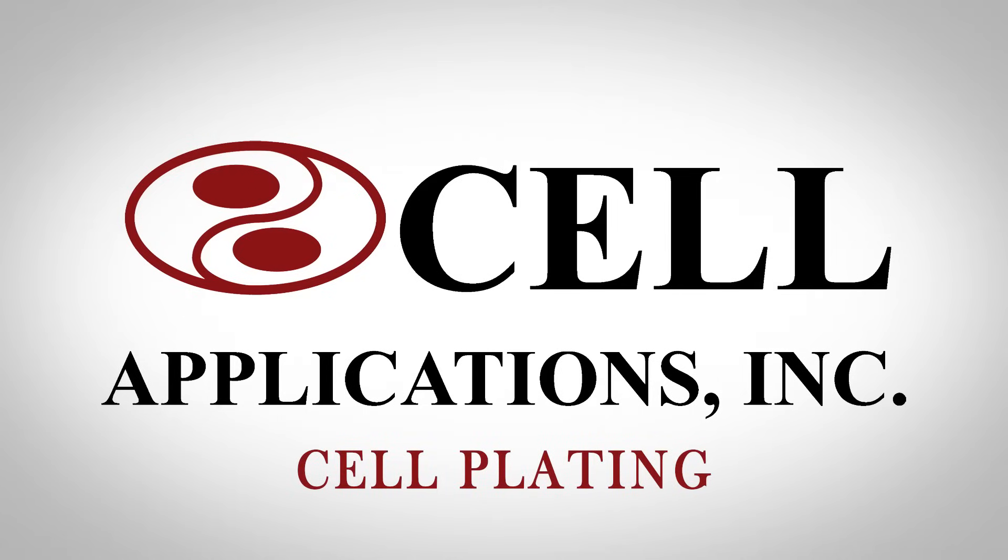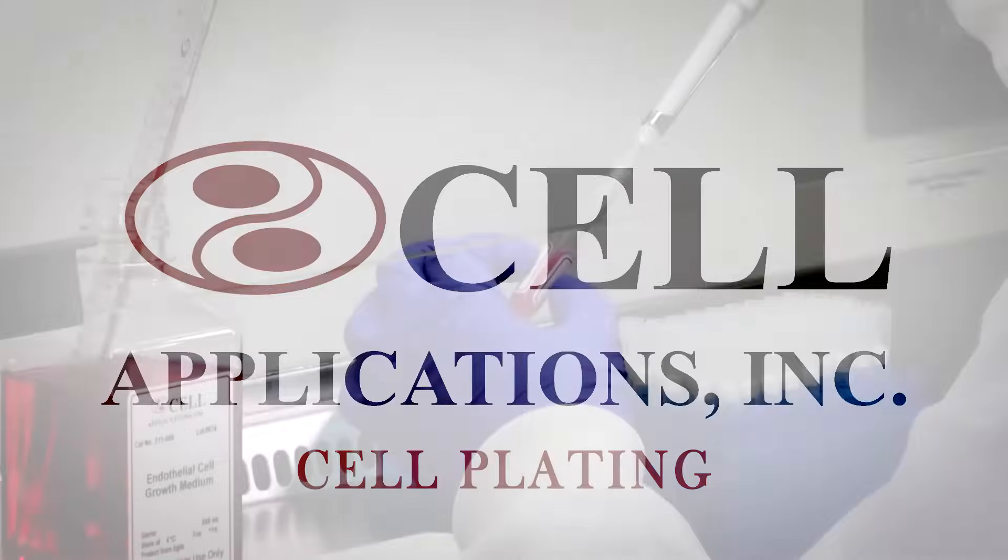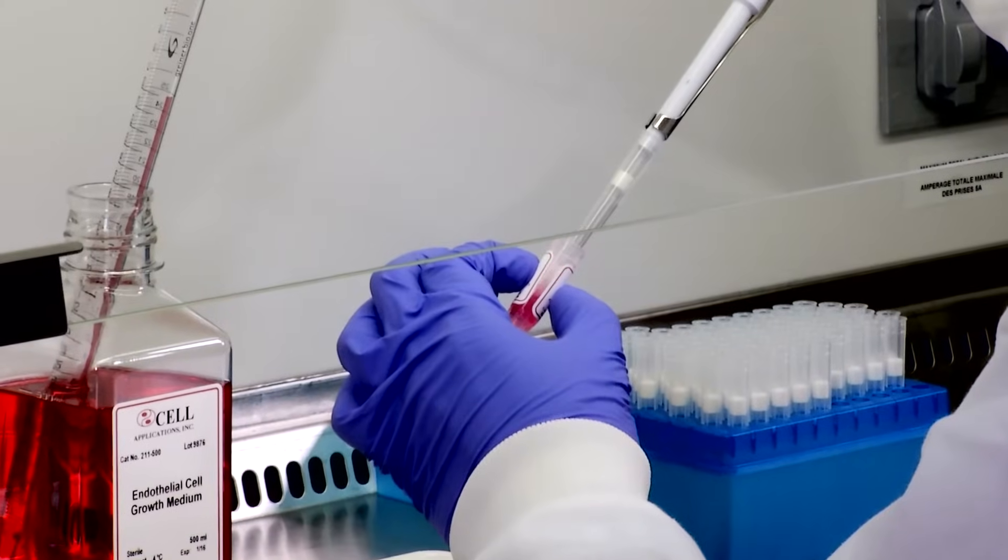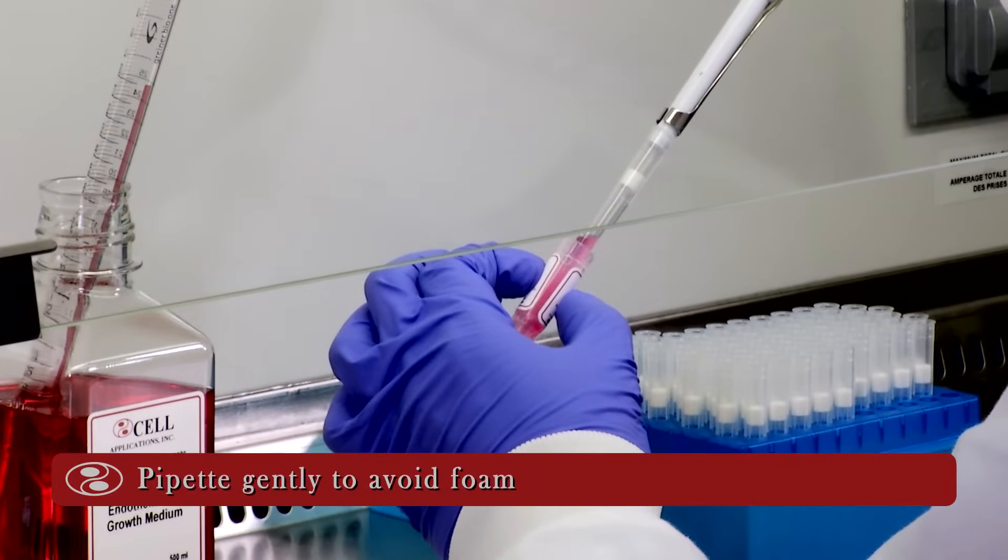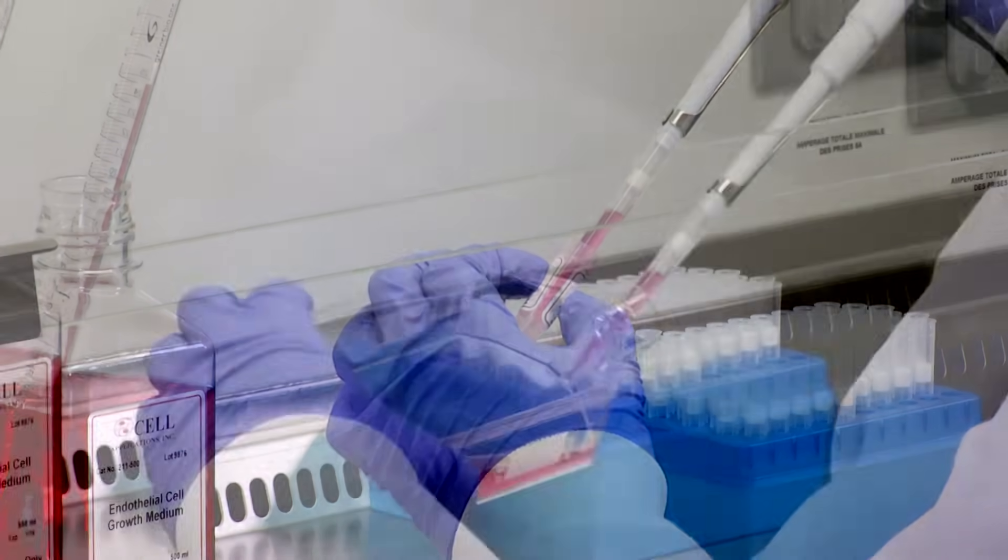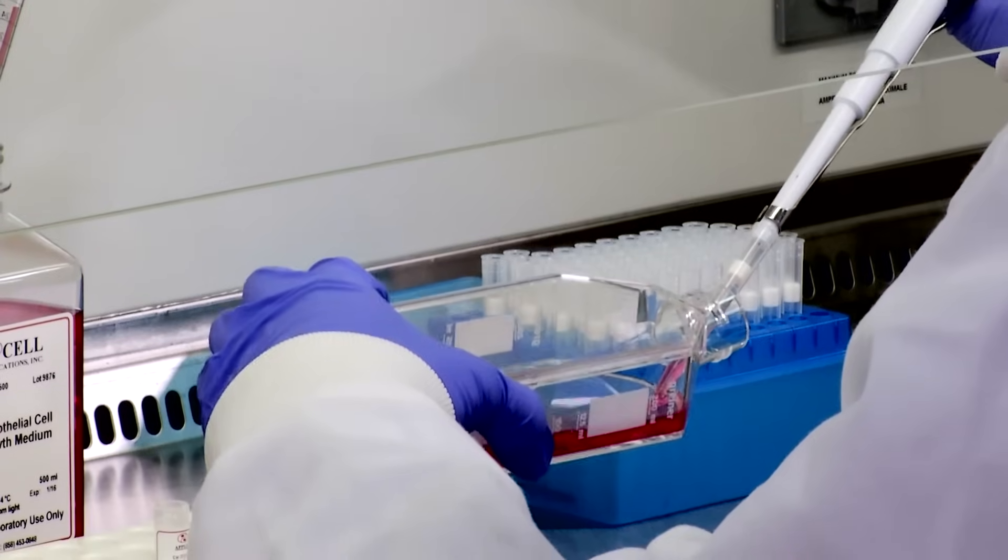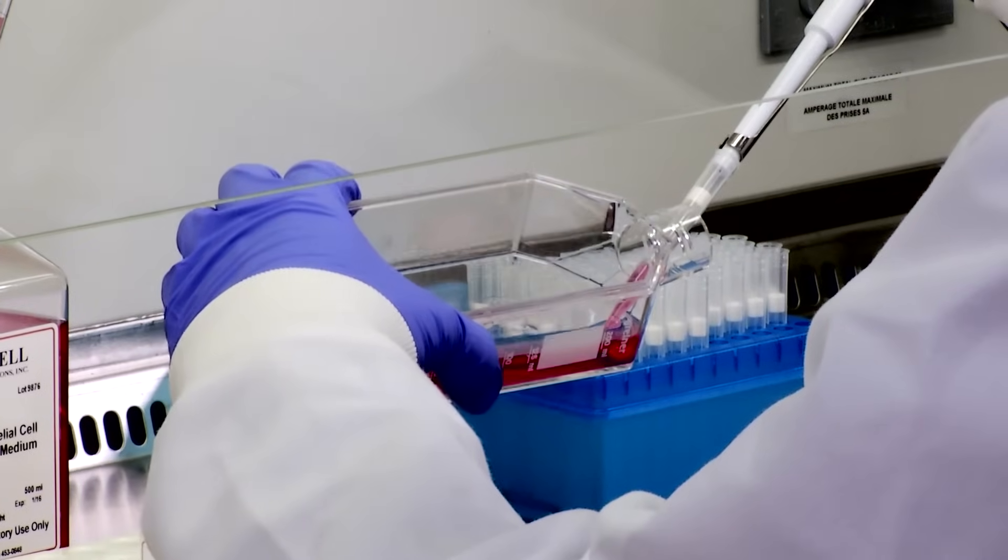Cell plating. Re-suspend cells three times with 1 ml pipet. Pipet gently to avoid foam. Transfer cells to T75 flask containing 15 ml growth medium.